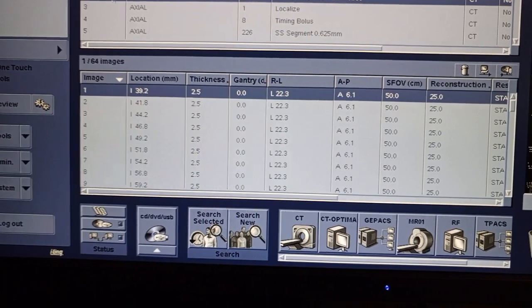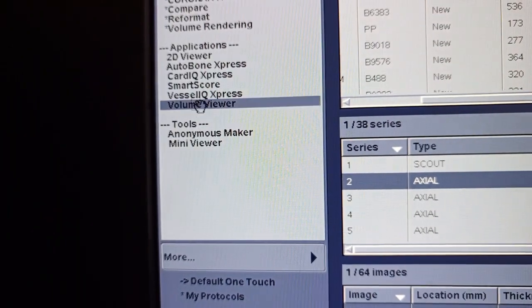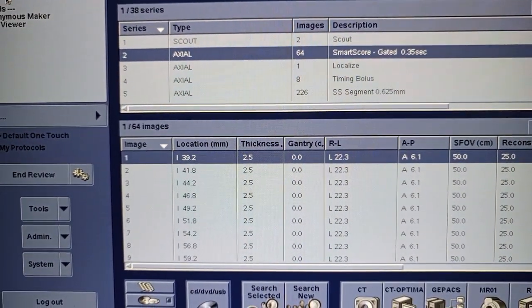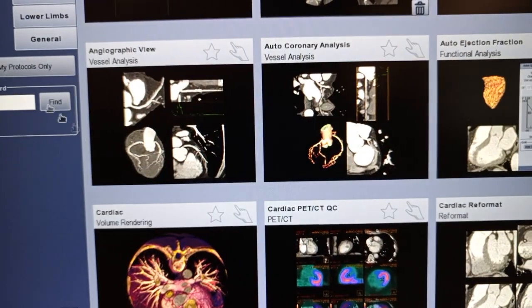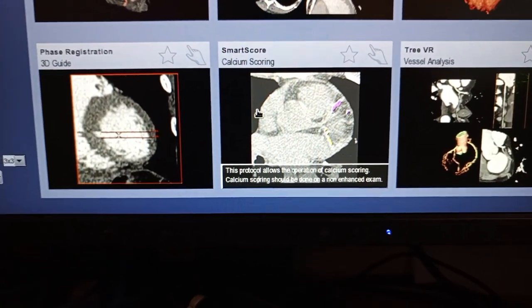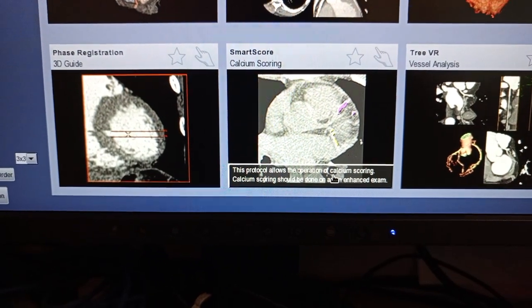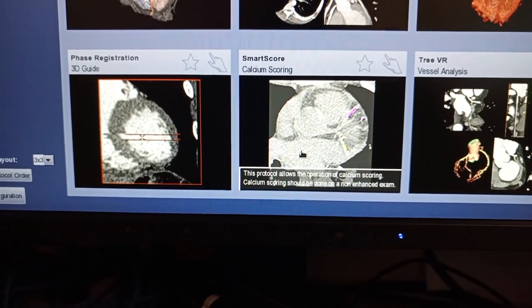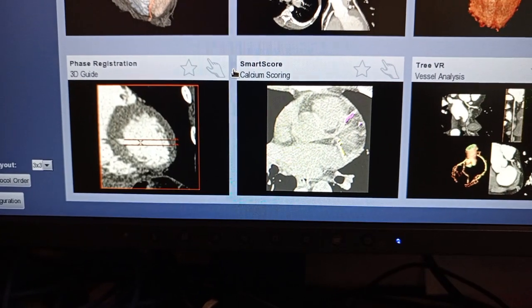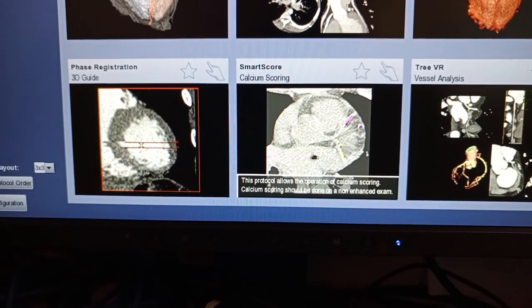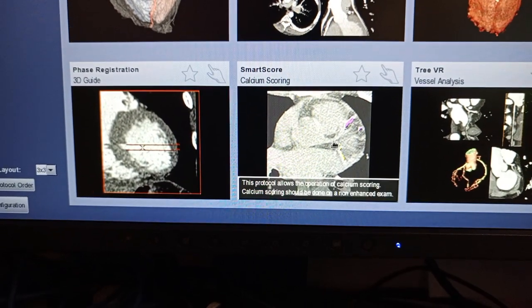What we do is click on Volume Viewer, then scroll down to what we call the Smart Score calcium scoring. It says this protocol allows the operation of calcium scoring. Calcium scoring should be done on a non-enhanced examination, so basically you don't give any contrast — it's a non-contrast procedure done around the heart. Click on it.